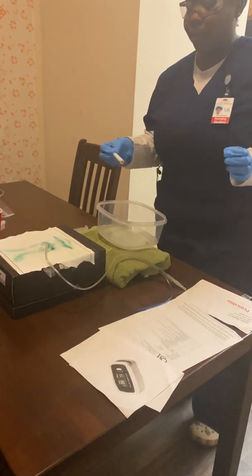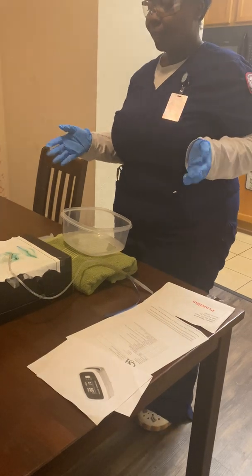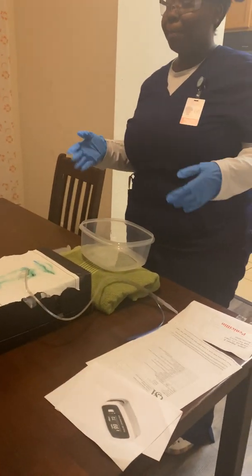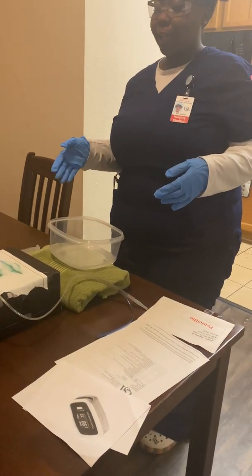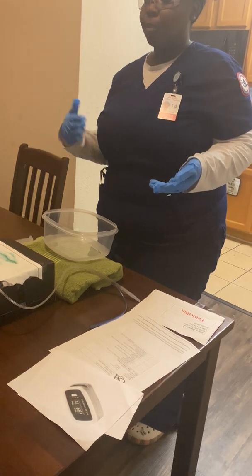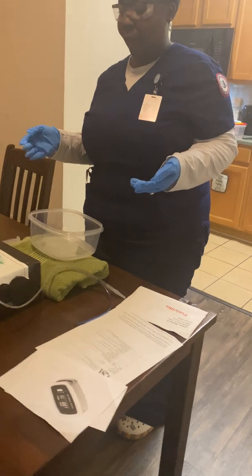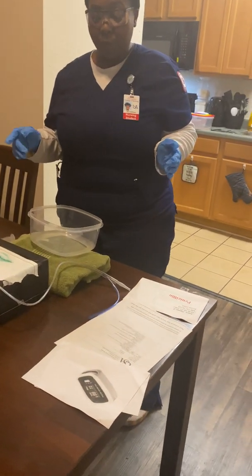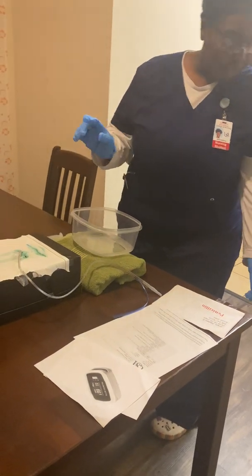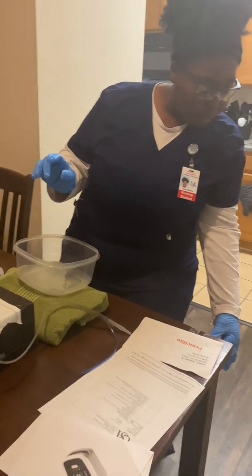and also use my tongue blade. And then after I use my tongue blade, I will also assess for correct placement by aspirating gastric secretions or using the pH or x-ray. And then after I have done that, I would get ready to remove my temporary tape and get ready to place my permanent tape. So I'm gonna get my permanent tape in my hand.